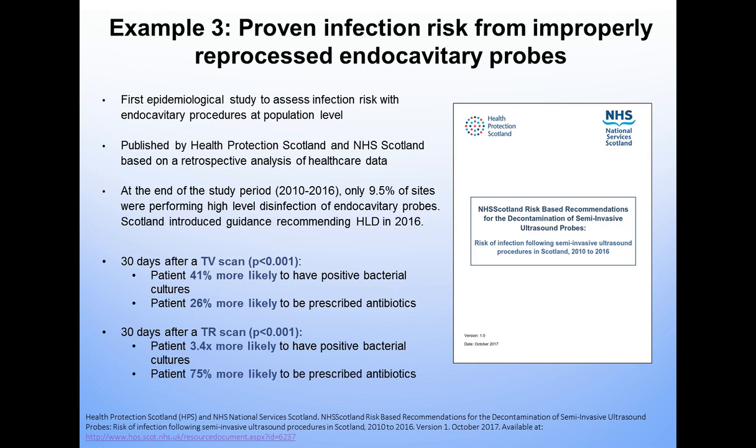Similar picture with a transrectal scan, but with even greater increased risk. So this is the first study that has really explored this in a lot of detail, and I think underscores the need to perform high-level disinfection of these endocavitary probes.